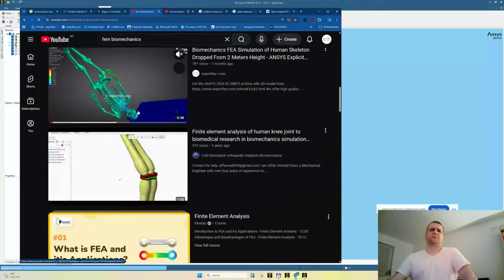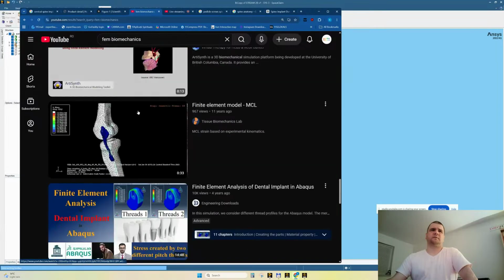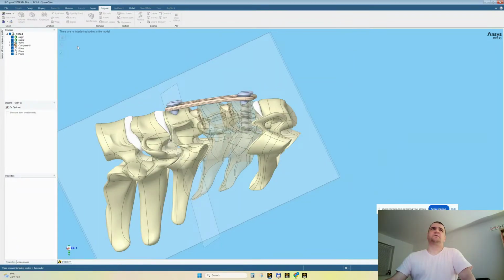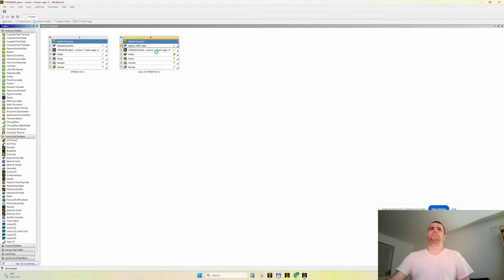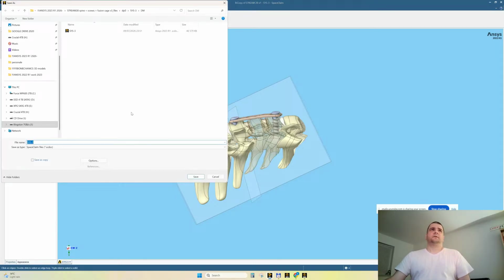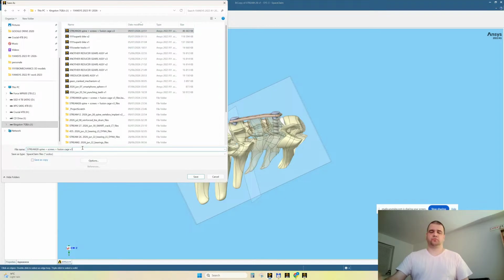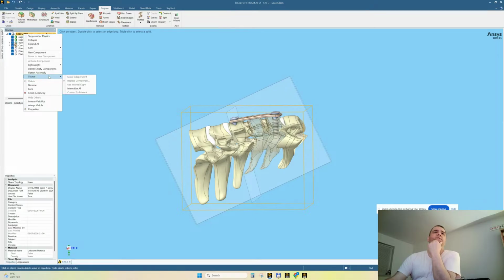Biomechanics. Oh my god. This looks promising. So there are no interfering bodies, all right? Save. And let's also save it externally. Source internalize all.